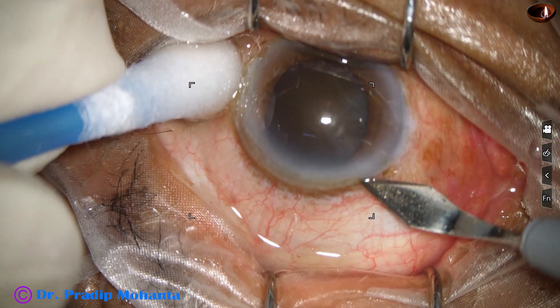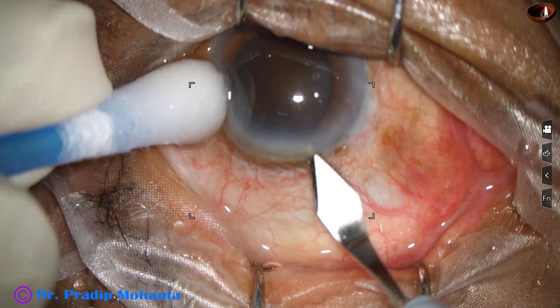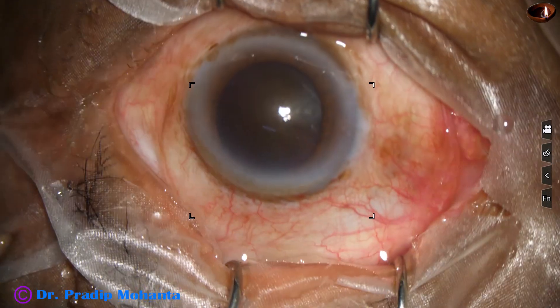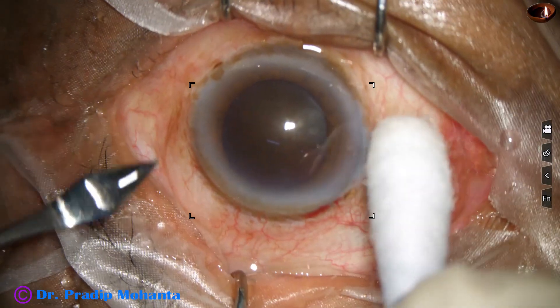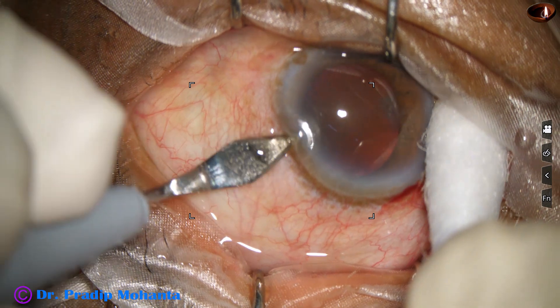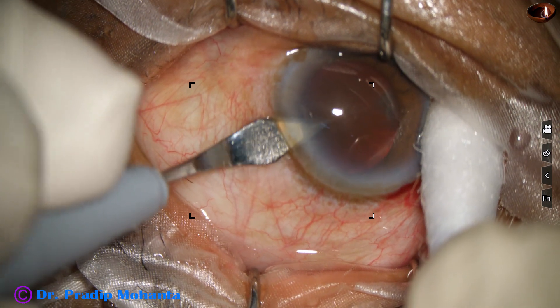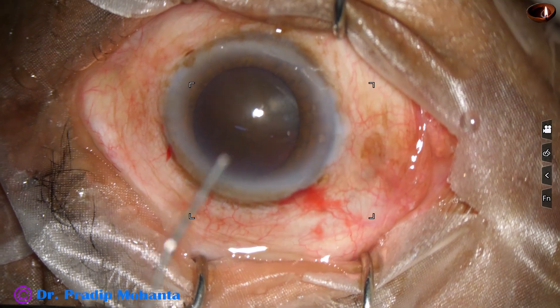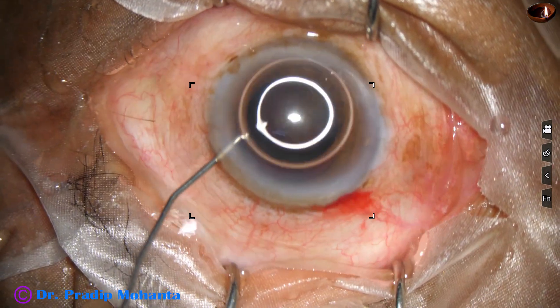This is the main incision with a 2.8 mm steel keratome. As you can see, the cataract is very hard — nuclear sclerosis is about grade 6. This is the side port on the left side of the main incision, created with the keratome itself. The keratome goes midway and we get an adequate sized side port.